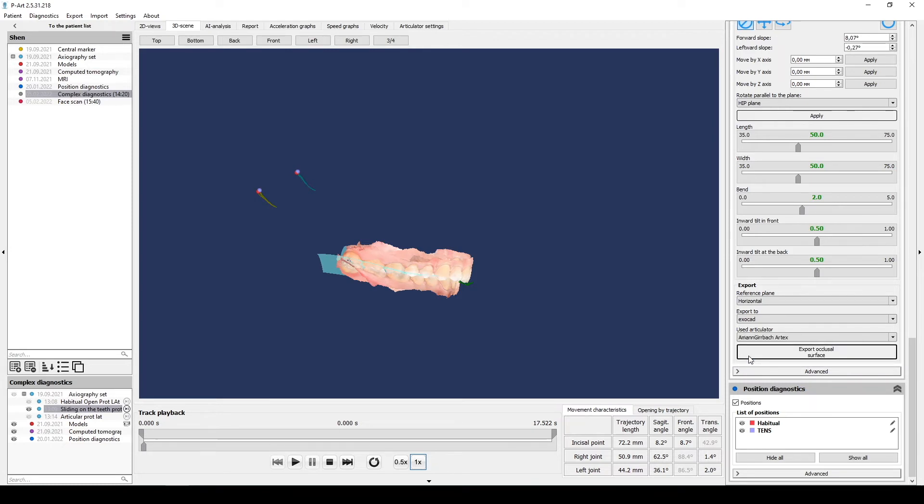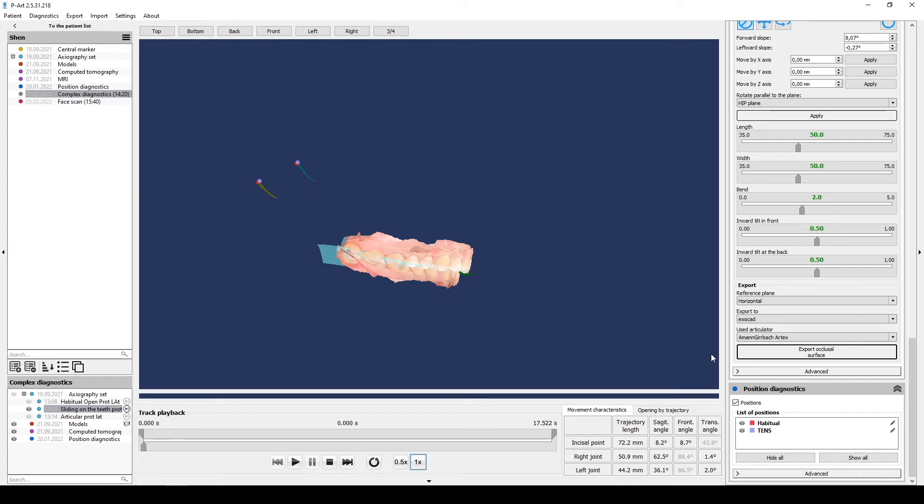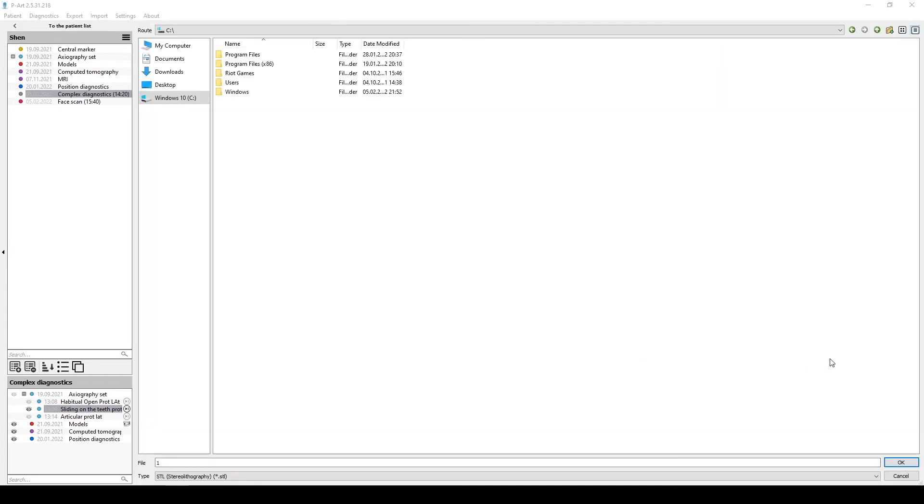All extra diagnostics which you export to ExoCAD must have the same reference plane with individual models. Click Export occlusal surface and select the location where you want to export it, name it like Occlusal surface. Occlusal surface has STL format.